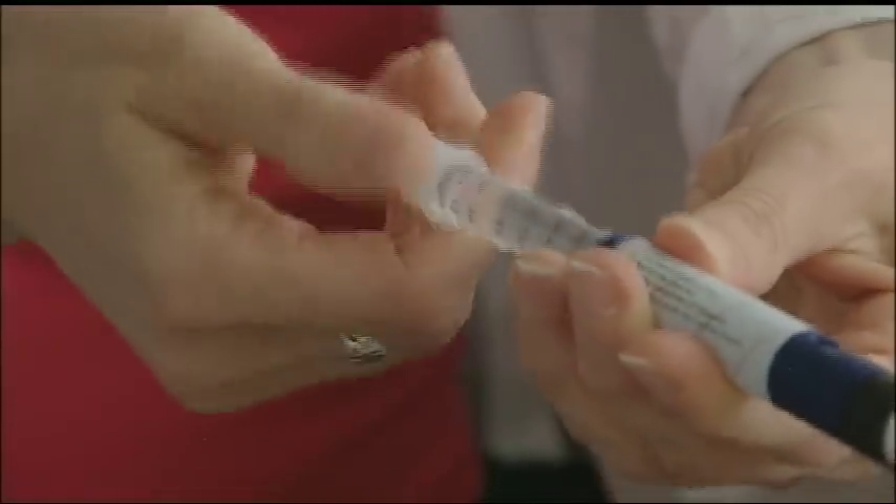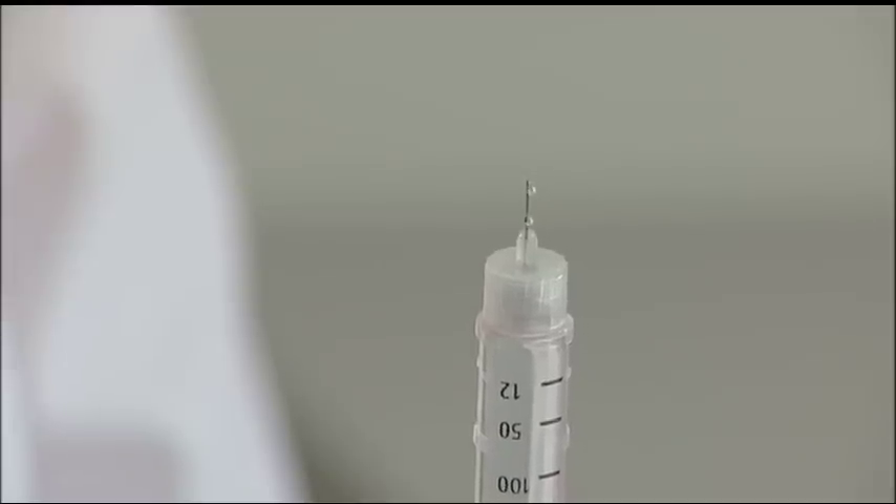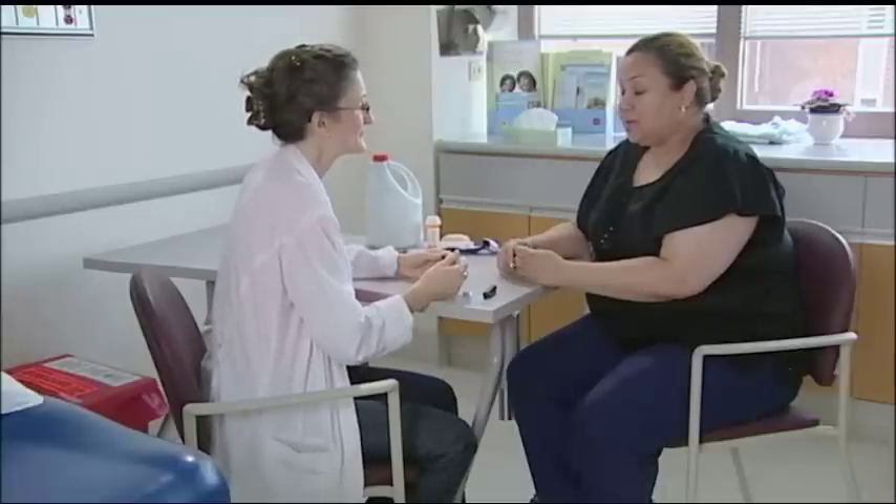Take your pen needle, remove the paper tab, and push it onto your pen. Dial to a dose of two units to prime any air pockets out of the cartridge. Point the needle in the air, tap on the side, remove the outer cover, then the inner cover, and press the dose knob until you see some insulin come out the end — that's priming your pen.